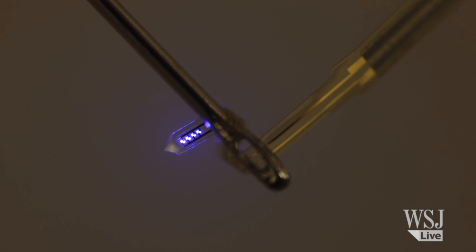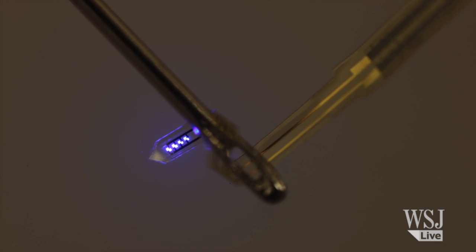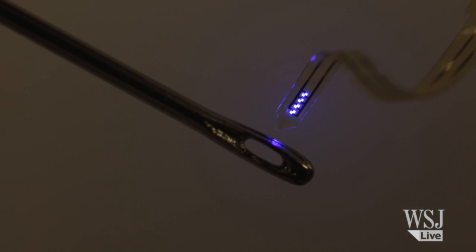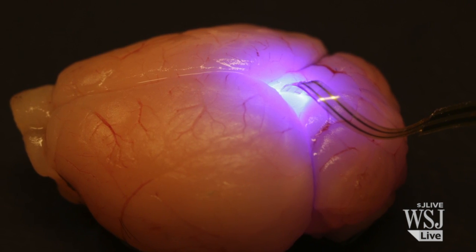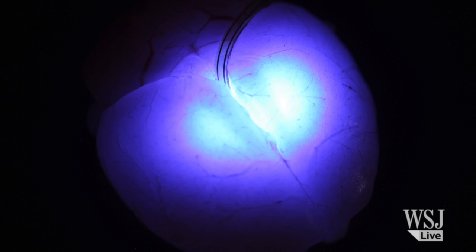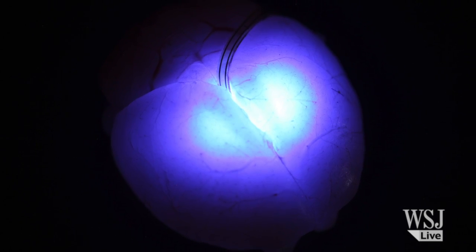Threaded on a wire one-fifth as thick as a human hair, these tiny lights can be injected into a living brain to activate special networks of light-sensitive neurons. Here, the lights are illuminating a rodent brain.